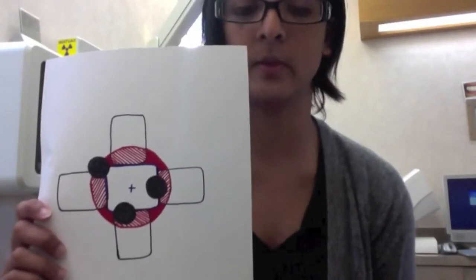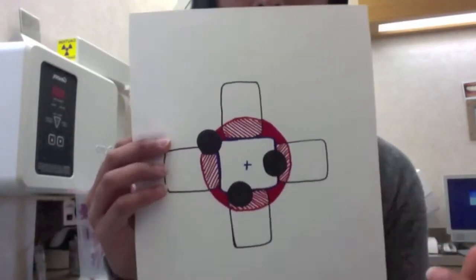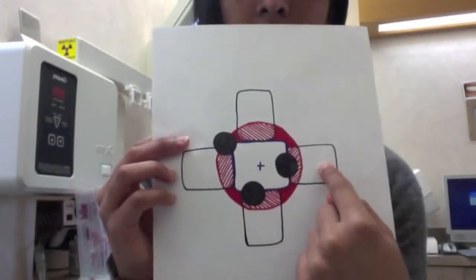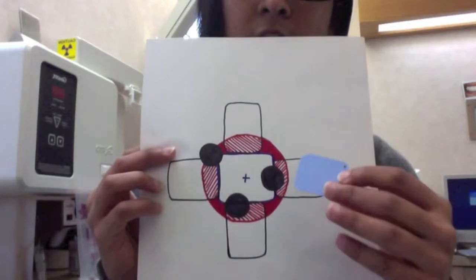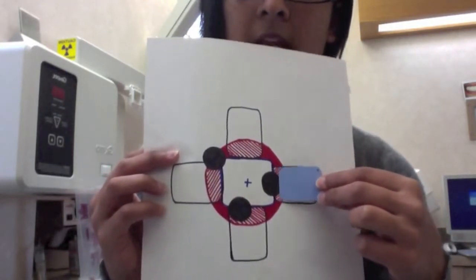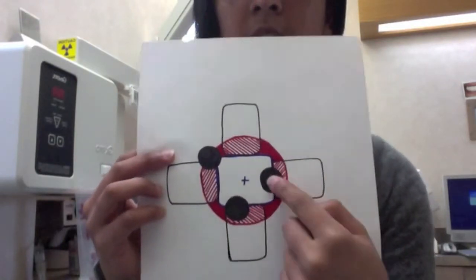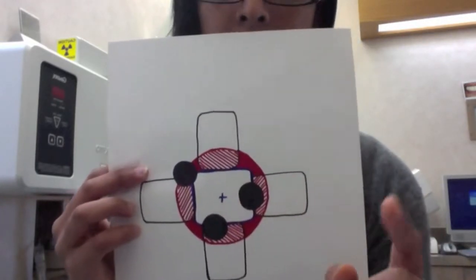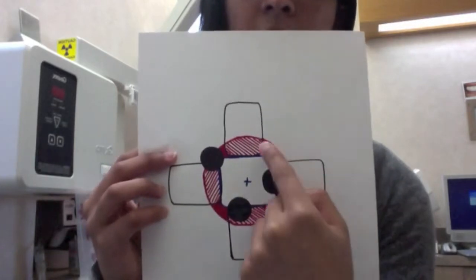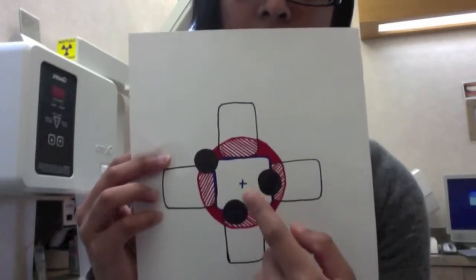So this is how we're actually going to test our theory about the difference between a rectangular and a circular collimator. We're just going to take this piece of layout, and the square boxes that are evenly spaced are where we are going to place size 2 intraoral films. We're going to tape them onto the squares, and the black circles represent coins. And we're going to take a round collimator, and this entire red area represents the 2.75 inches that are going to be exposed by the round collimator.